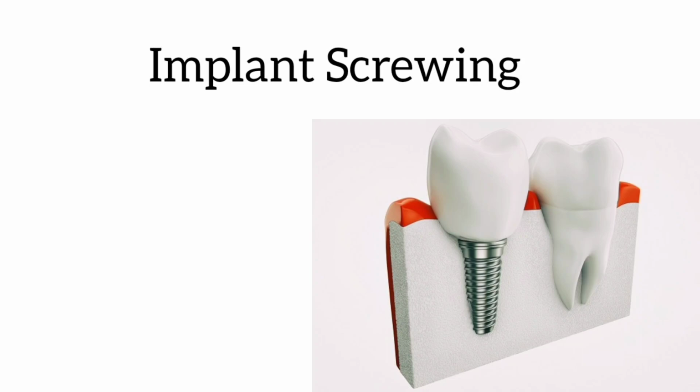The top surface of the implant, called the implant platform, should be flush with the bone level in D1, D2 and D3 quality bones, but should be submerged 0.5 to 1 mm in D4 type weak bone to prevent any occlusal pressures on the implant during the next few months of osseointegration. In areas visible on smiling and talking, the implant platform should be 2 mm below the cemento-enamel junction of the adjacent teeth. This allows for a more natural appearing soft tissue emergence around the future implant prosthesis. Once the implant is placed, its top surface is covered with a cover screw or a healing cap.